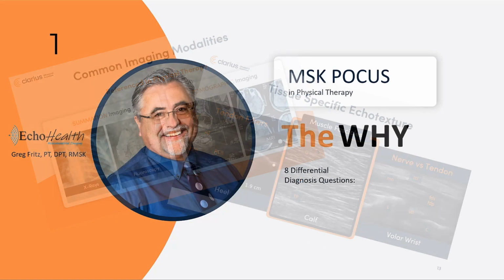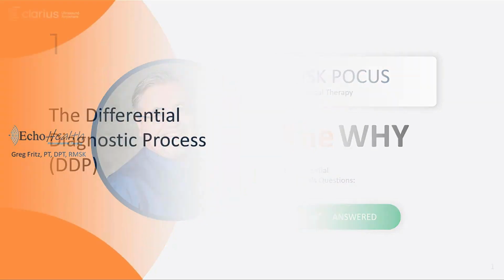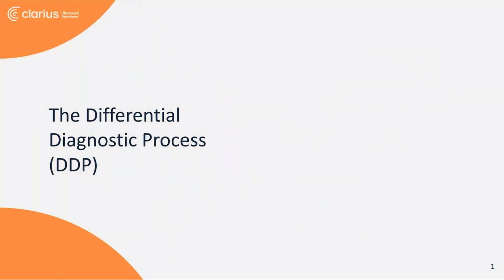This particular video, I am hoping to platform our process of identifying the working diagnosis, and so I have provided a subtitle to the why, being 8 differential diagnosis questions answered. And I'd like to spend some time talking about how we get to a working diagnosis, and that involves going through the differential diagnostic process.